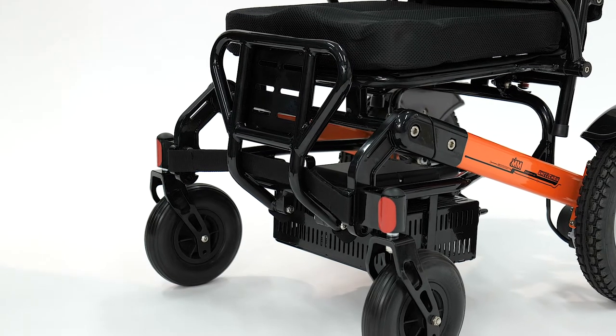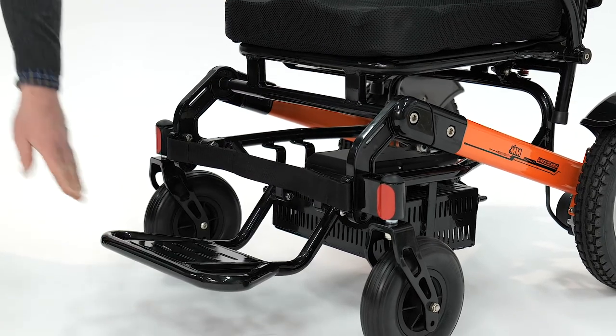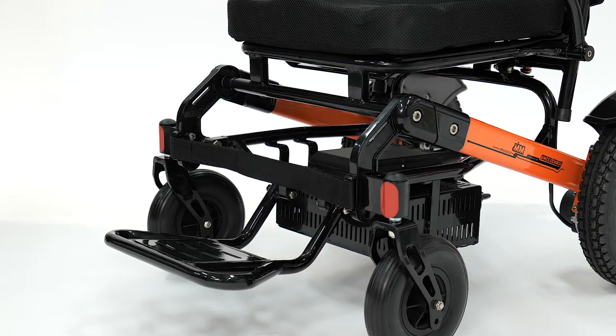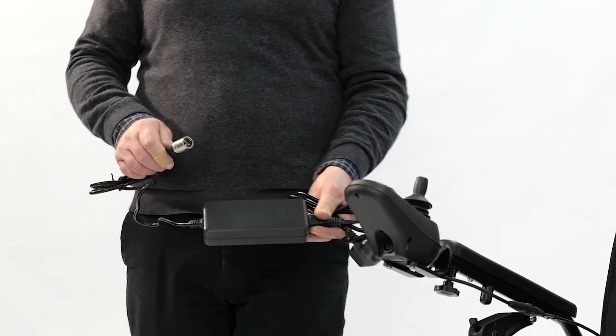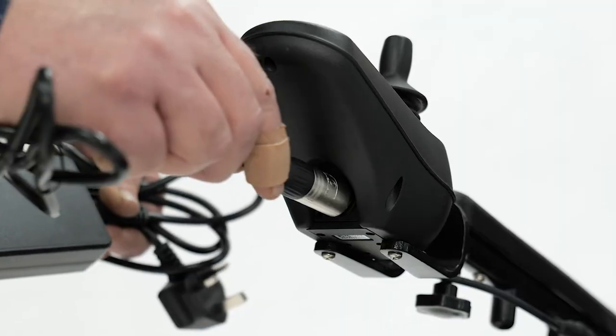The power chair has a central fold-down foot plate. Your power chair comes with its own charger and the socket is located underneath the controller.